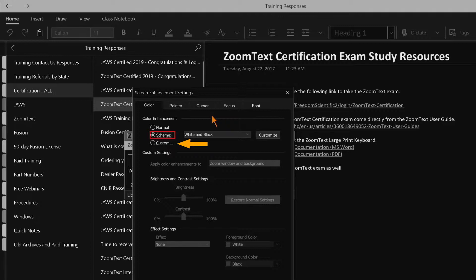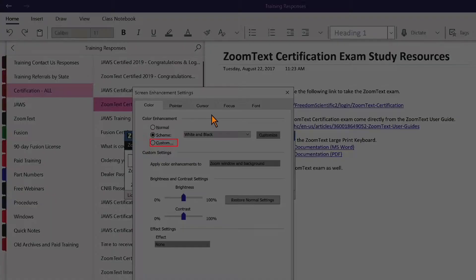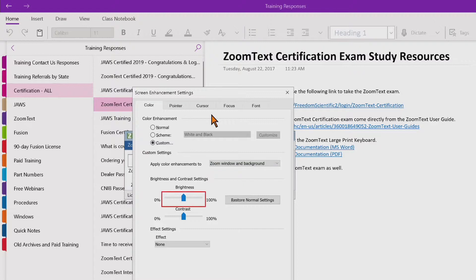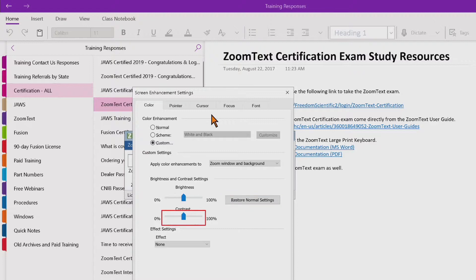Choose Custom. I'll press tab to move through some of the controls here and we'll explore them as we go. Custom settings group box: apply color enhancements to combo box — zoom window and background. We'll leave this set to apply enhancements to the window and the background. Here you can adjust brightness, and there is also a restore normal settings button and contrast track bar at 50%.